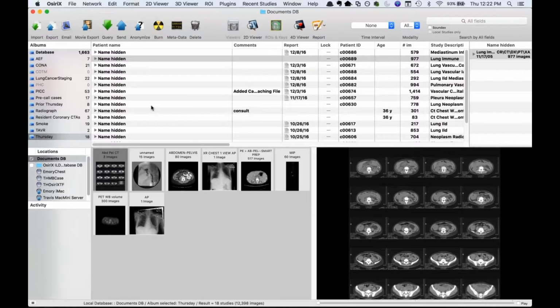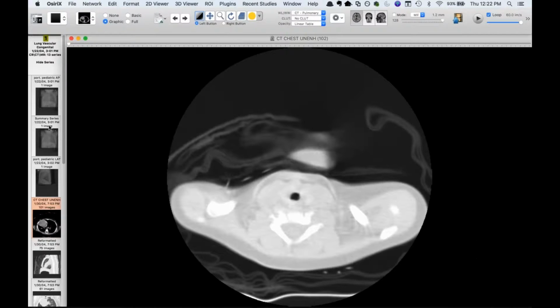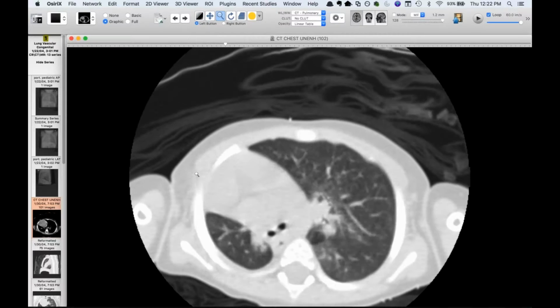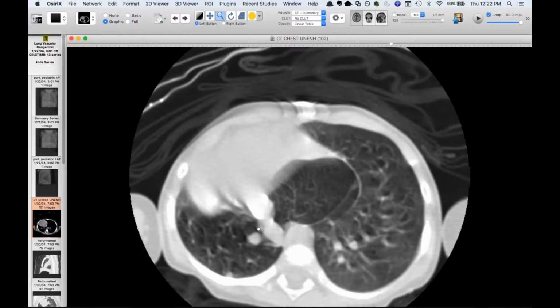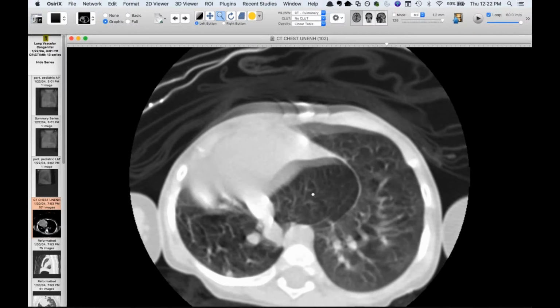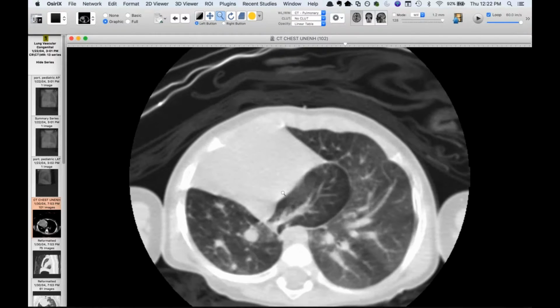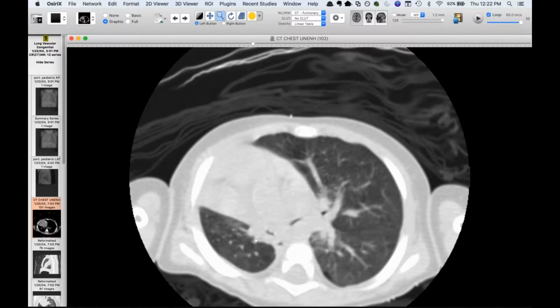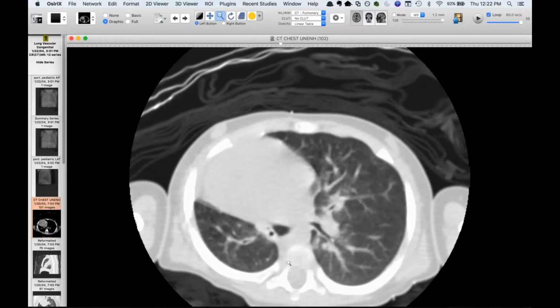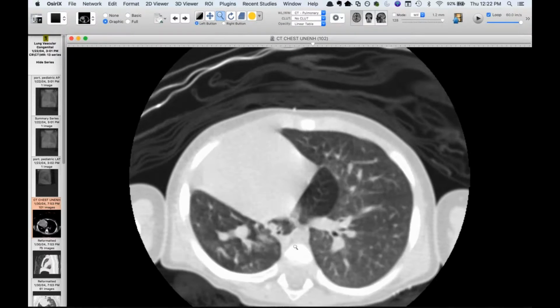So yeah, I'll show these in succession just really quick, because this is Jeff. This is from our collection of scimitar cases, and I just showed this one because, when I was digging through, I finally found one of these variants of scimitar. But you can see here is a scimitar vein. It's draining here somewhere into the IVC, but you have this cool little part of the right lung that herniates across midline, and you can even see the airway coming off the right lung. And this is a really funky right main stem bronchus. It gives off really one lobe into the actual lung over here, and then I don't even know what this little branch is, and then this one that goes posteriorly.